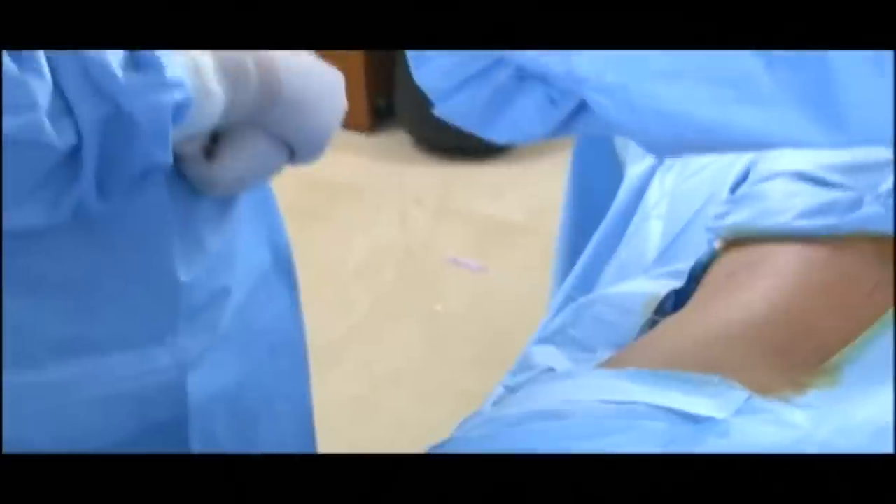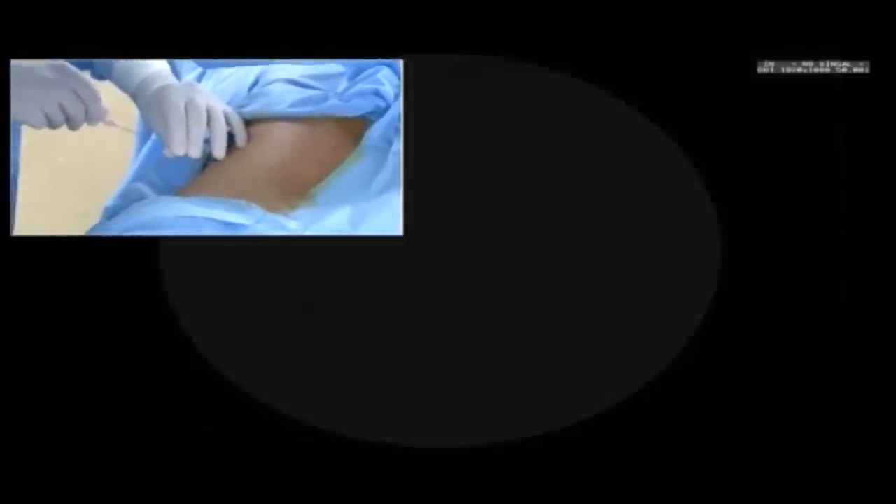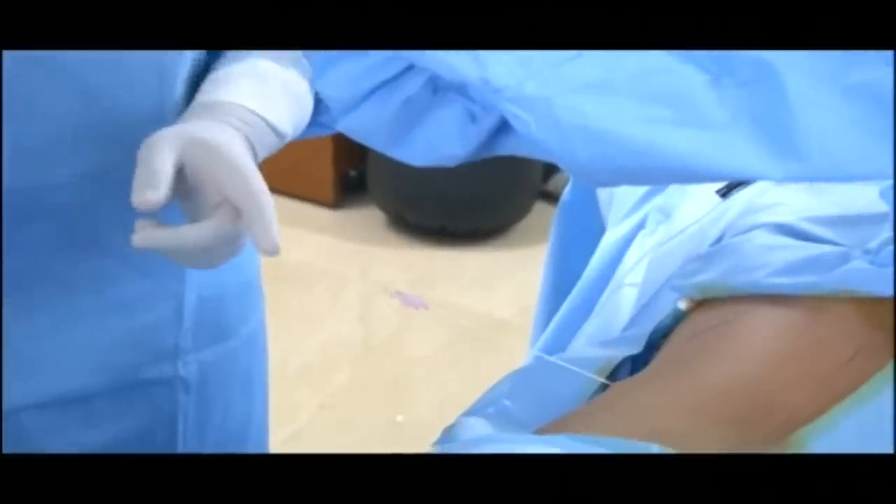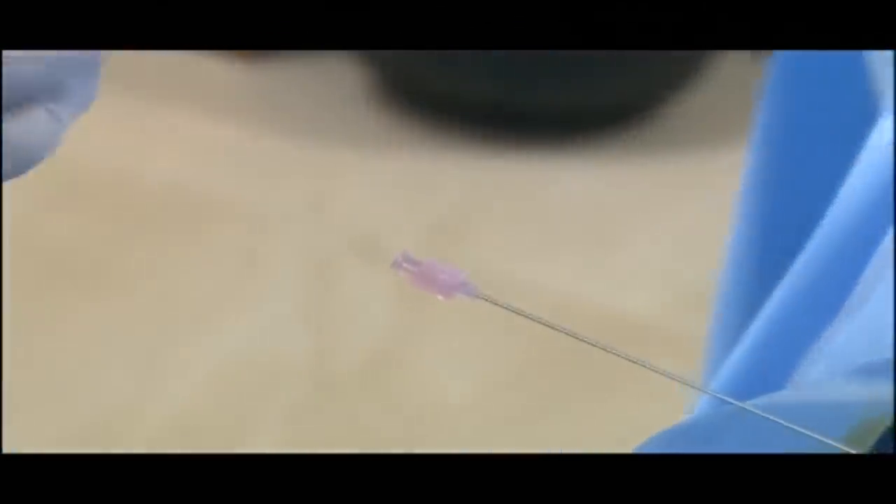Can I have the oblique view, please? Do you ask your assistant to push some more saline? Not now — when I want to confirm my puncture. You are going a little anterior now. Yeah, slightly anterior. I think I must be able to feel the stone. Now, can you see the saline? It is clear. Are you able to appreciate the saline flow? Very, very clear. So now this is the main point — it has to be a clear fluid.